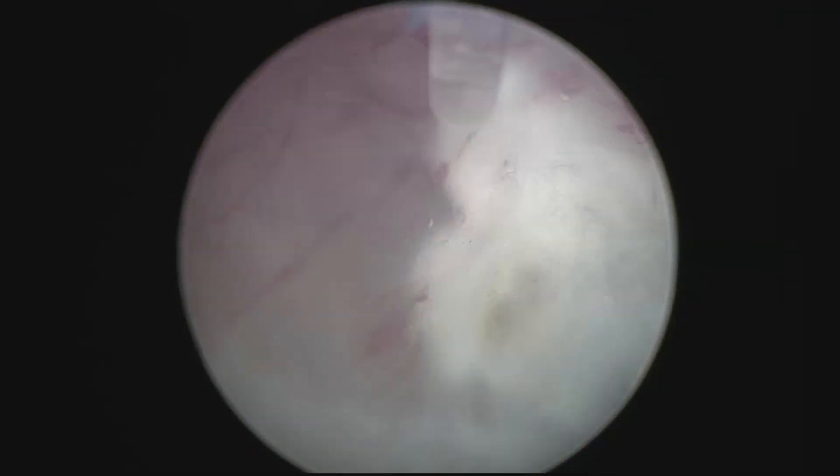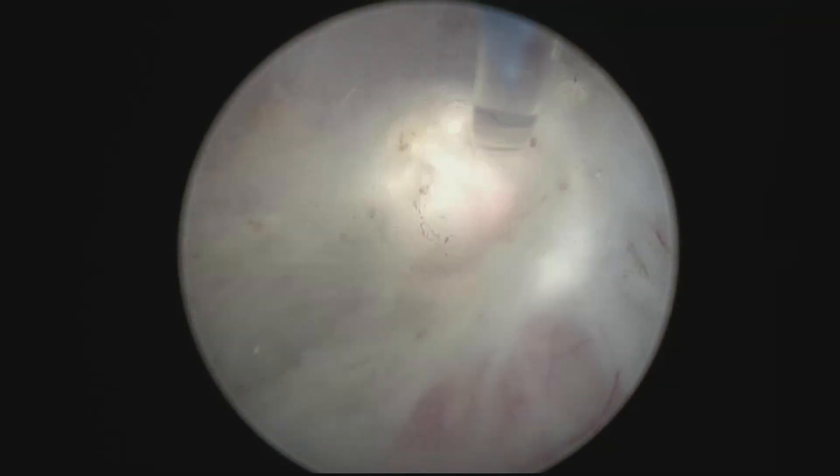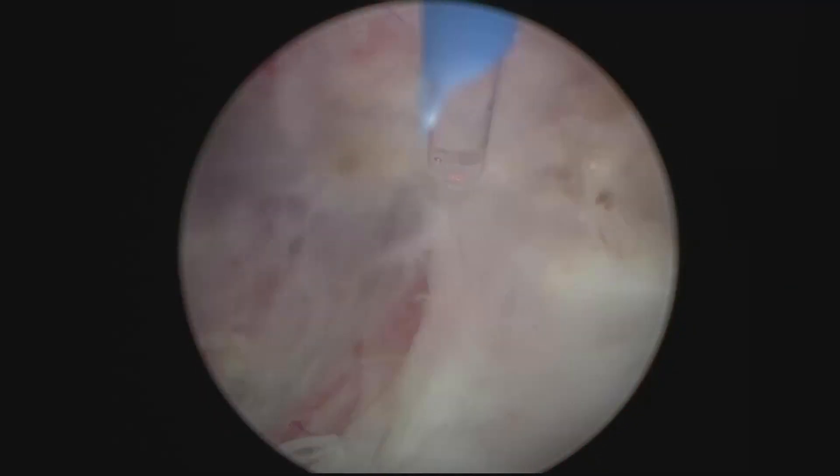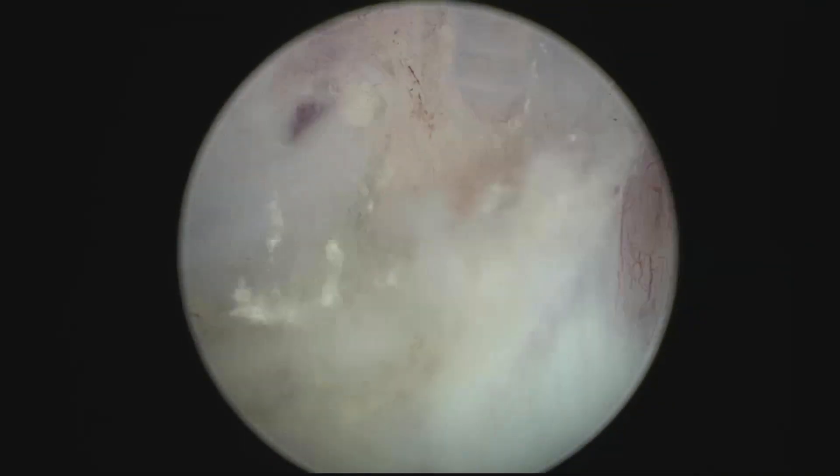I like to keep the camera fixed at 12 and the fiber fixed at 12. So I like to do a posterior dissection initially, take it a little bit into the prostate in the direction of the bladder neck, without taking it too far, just dissect what is possible to dissect. In this case, the plane is not very beautiful. I think this saves a lot of time and makes the procedure much faster. You have to be always aware that there might be nodular growths that are growing inside the capsule. Always looking for the good plane, but also keeping an eye on the possibility of nodules that grow, pushing the capsule and compressing it.